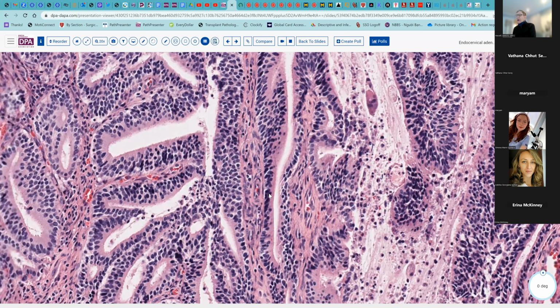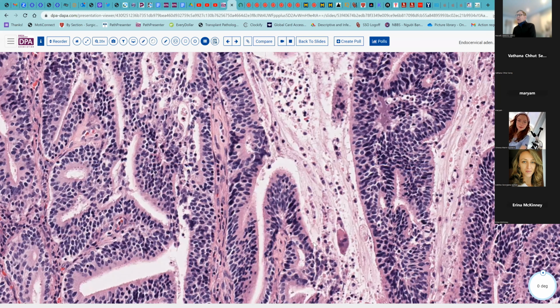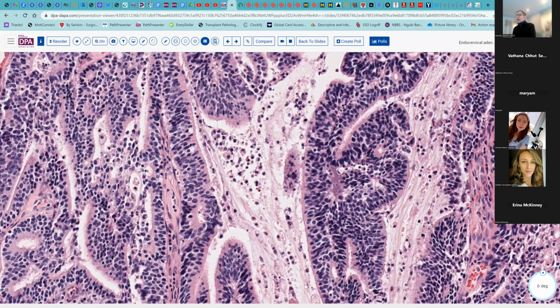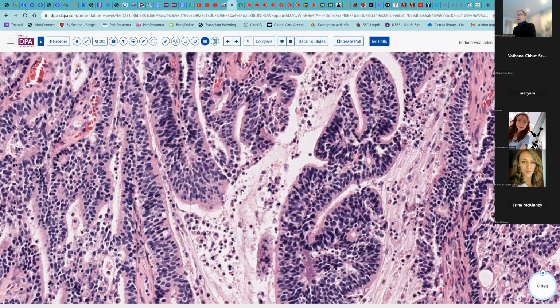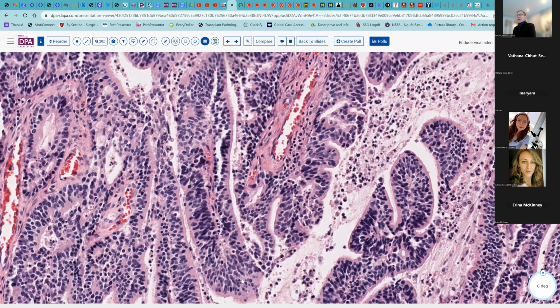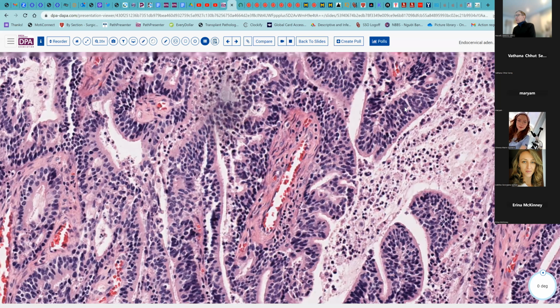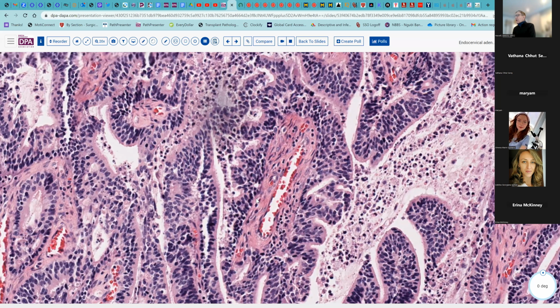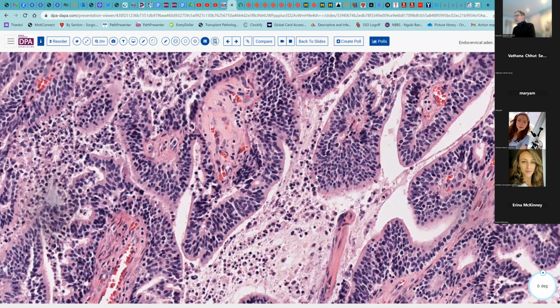And as we look around here, we should be able to find some luminal type mitotic figures. They're usually readily identified, and I think I have some here. If I could find them. But typically with conventional endocervical adenocarcinoma, the cells sort of migrate towards the lumen as they're about to divide.